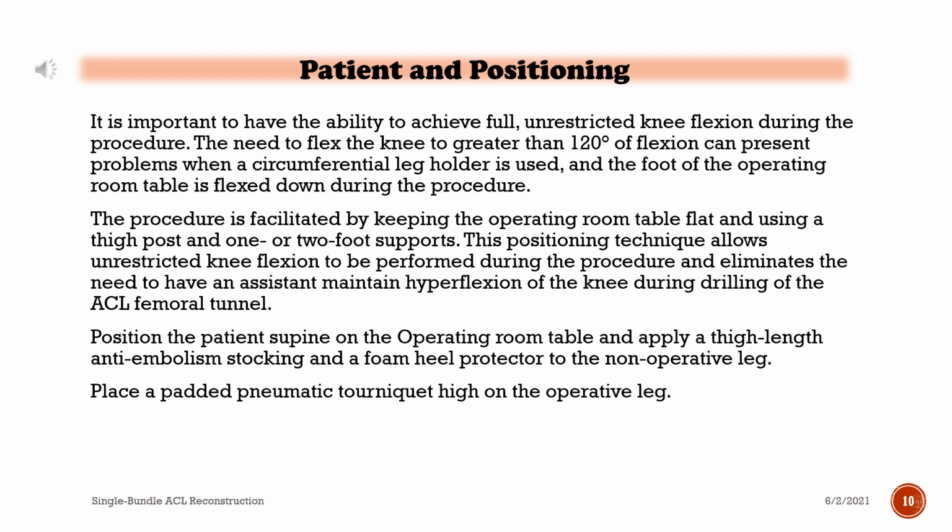Position the patient supine on the operating room table and apply a thigh-length anti-embolism stocking and a foam heel protector to the non-operative leg. Place a padded pneumatic tourniquet high on the operative leg.